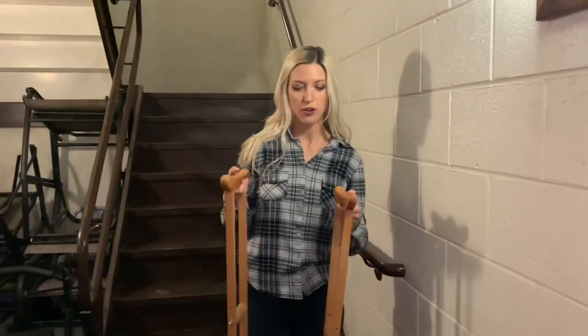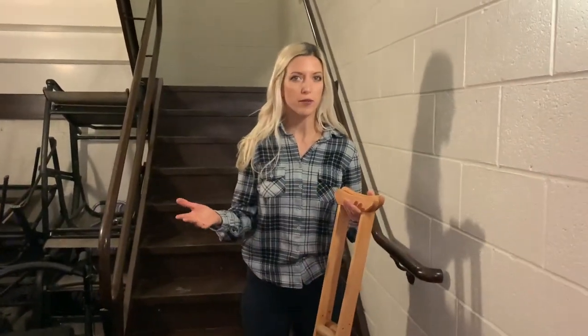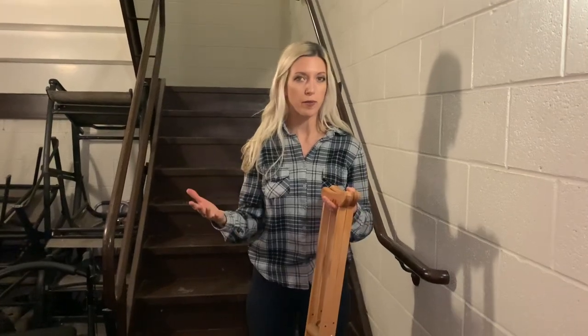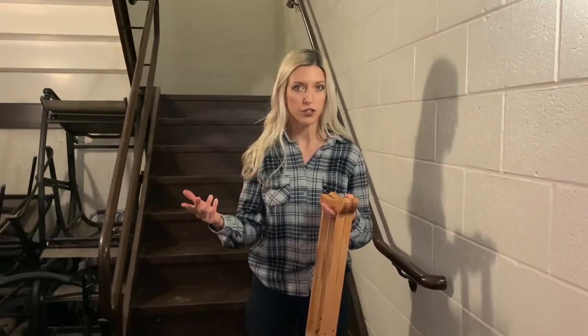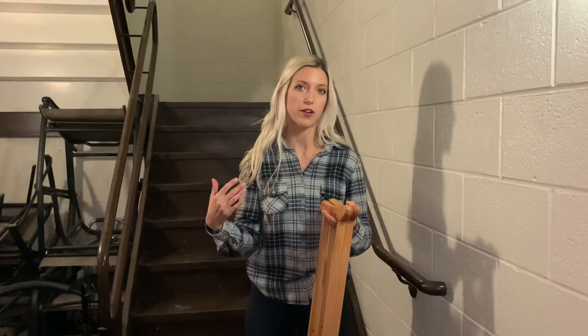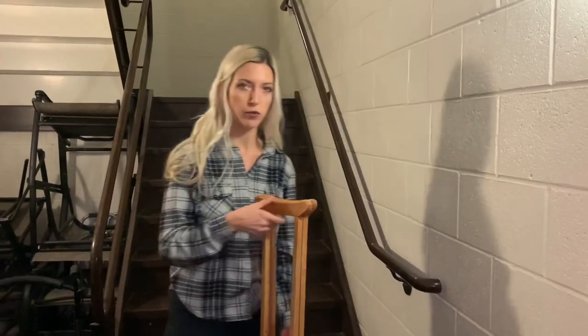Now I'm going to show you how to use crutches to go upstairs. So a way to remember how to go up and down, we remember the saying, up with the good, down with the bad. So when you're going up the stairs, you're going to go up with your good foot first. And when you're coming down the stairs, you're going to come down with your affected or injured leg first. So we will go up first.